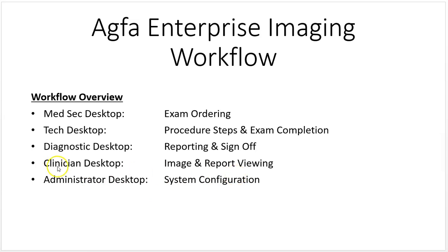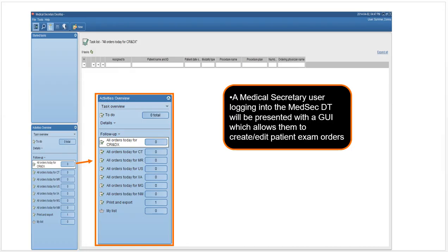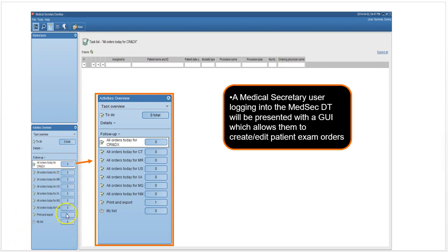This is the medical secretary desktop. Once you log in, this is what it looks like. The acquisition desktop looks very similar to this. Here you will have an activities bar where you can just click on these buttons and you'll have different activities that you need to complete based on your role.